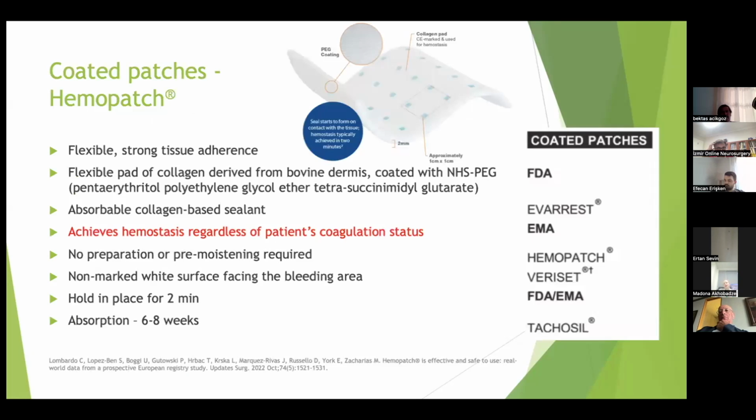Now, as I mentioned in the beginning, I will mention a few points about the coated patches, which are not included in the classification. So these coated patches, one of them is Hemopatch. You can see here. I'm not sure whether it is widely used, but I use it in a routine manner because I find it quite useful.